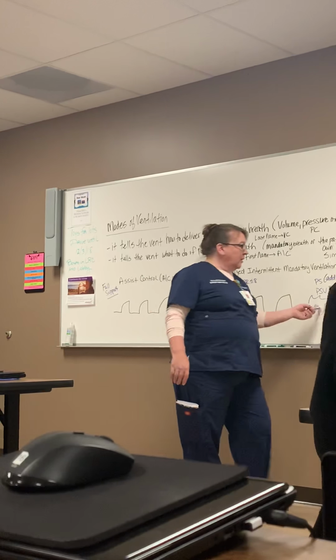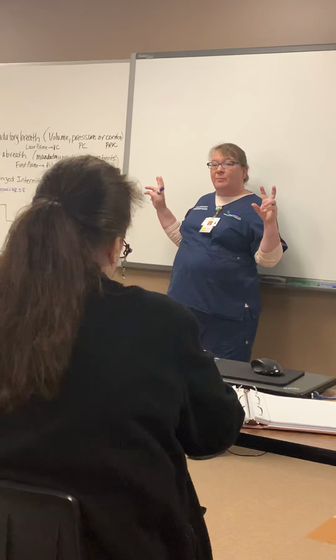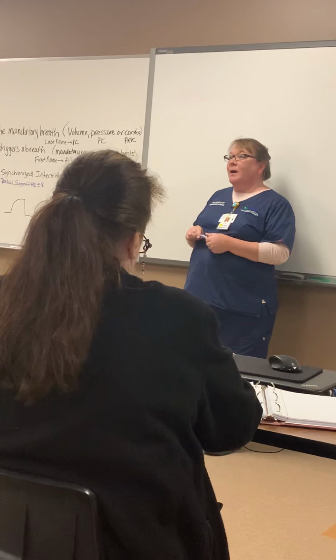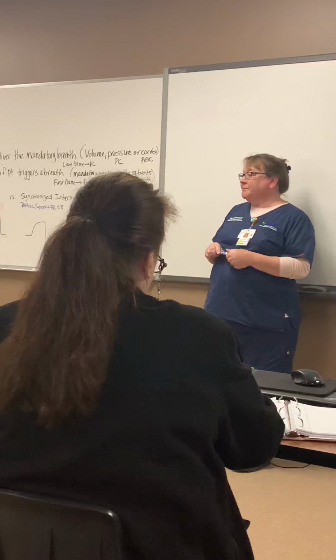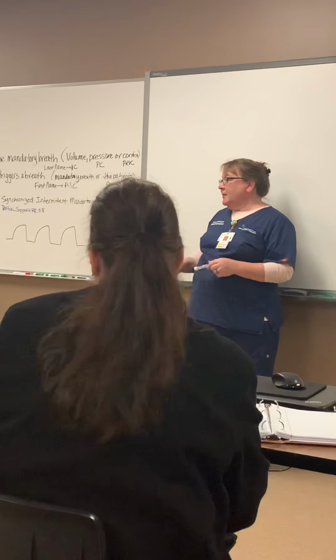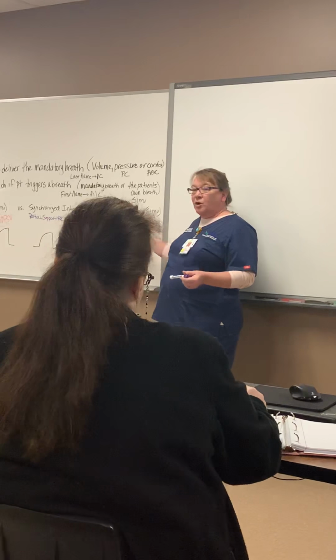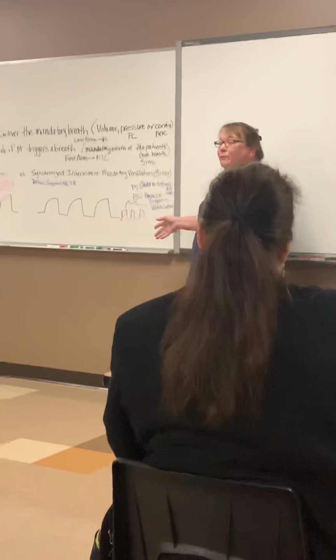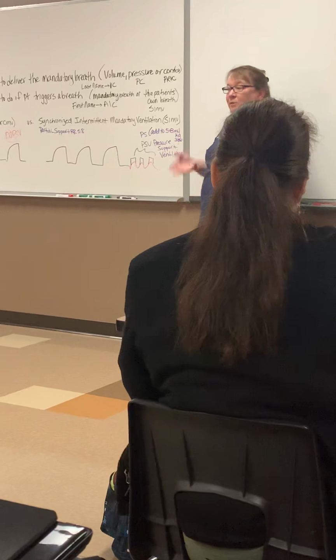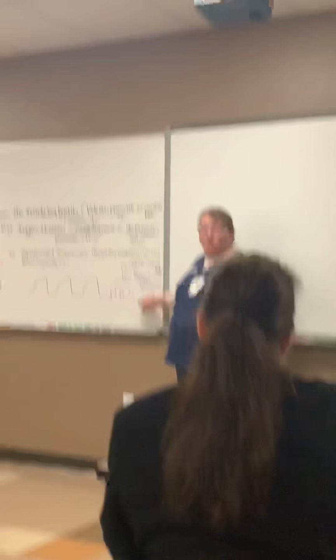Now, if I have a patient who has a pressure support breath, is that a spontaneous breath, or is it a partial support breath, do you think? Partial support. Why? Because they're not meeting what they should be pulling. Right, because even though pressure support is spontaneous, with the patient doing the effort, a pressure support breath is a partial support breath because we're helping add volume with pressure. As long as we're doing anything to help with the tidal volume, it's considered partial support.